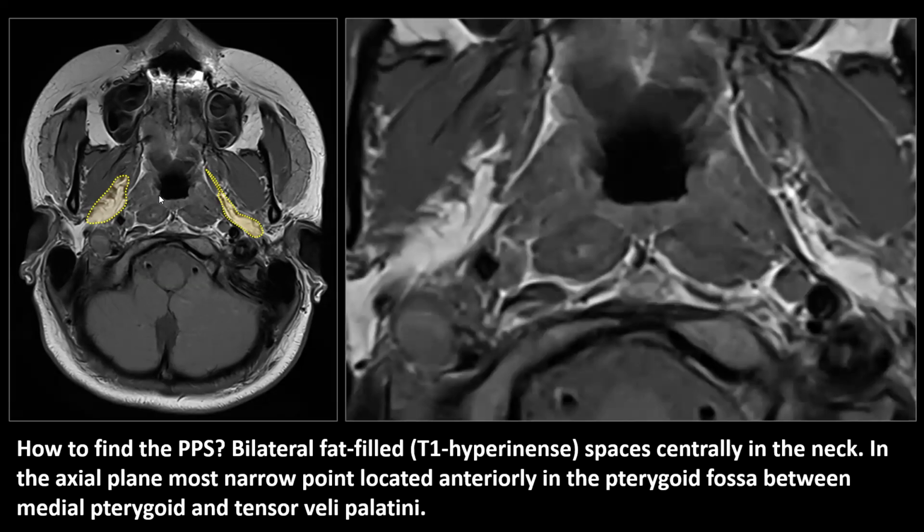and its most narrow point in the axial plane will be situated in the pterygoid fossa between the tendons of the medial pterygoid muscle and the tensor veli palatini. This is not so easy to recognize, but this here is the pterygoid. Here we have the insertion of the medial pterygoid located over here, and this very small tendinous structure over here is the tensor veli palatini. And this is the most narrow point of the parapharyngeal space.